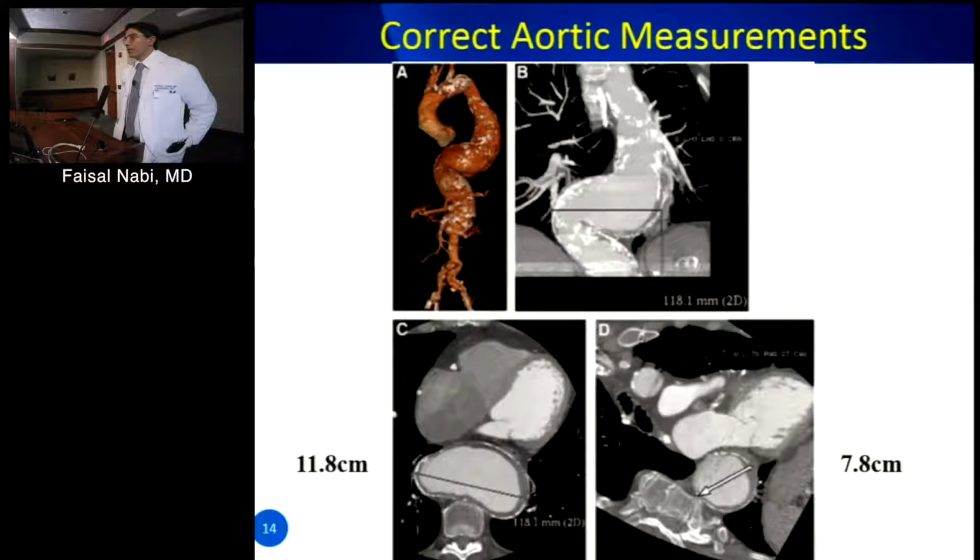Correct. Based on CT, yeah, absolutely. Why the difference with echo? My understanding is you're doing leading edge to leading edge, right? Exactly. So you're not getting the back wall. In that old study, we also found the best relation with the surgeon doing outside to outside. So we actually quit.